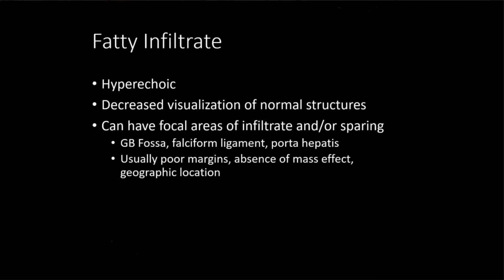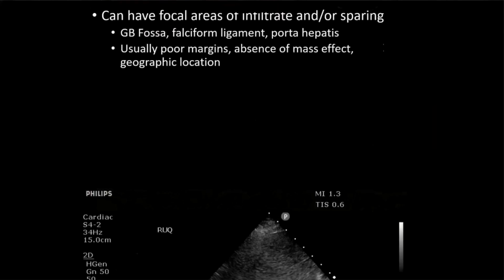Again, though, if you're seeing this and this person hasn't had a CT or a prior ultrasound, this is somebody that you want to make sure that you get confirmation that that's actually what you're looking at. So a formal ultrasound or a CT scan would be helpful in making sure that you're not missing some kind of mass there.